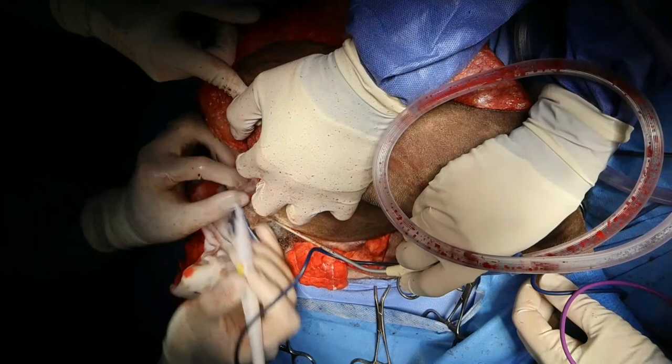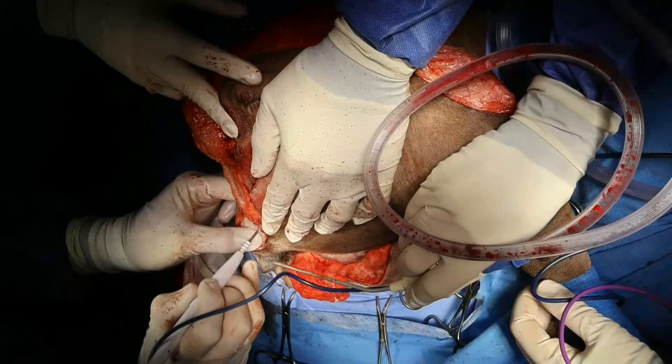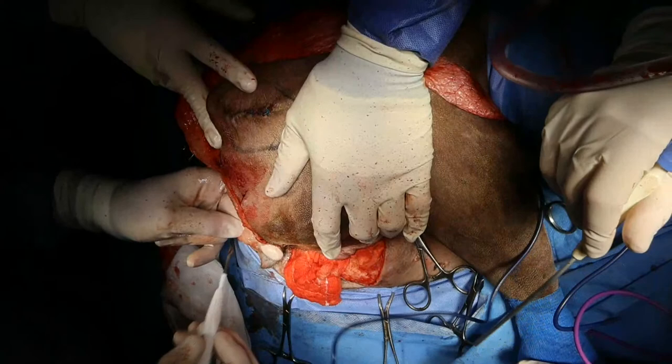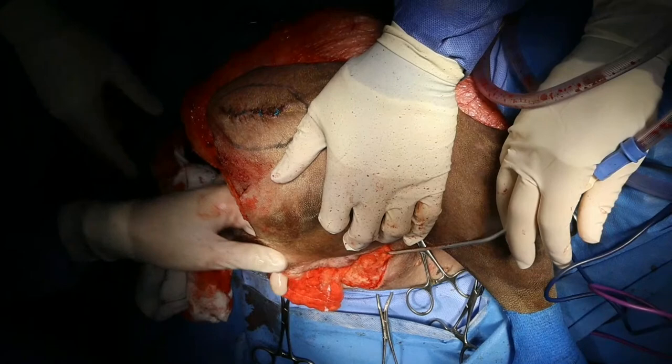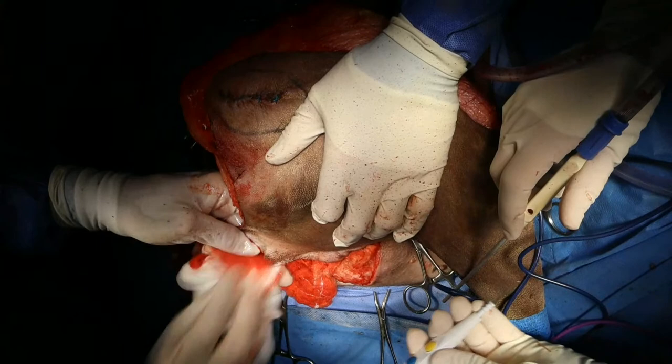Should you put a new cath in on recovery? You can do, yep. Sean's just asking if we should put in a new cath on recovery. So basically, this is all that's left here. This little skin bridge in front of the vulva. Bit of a bleeder here.